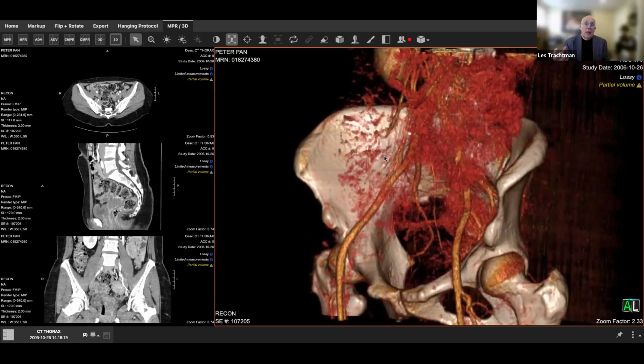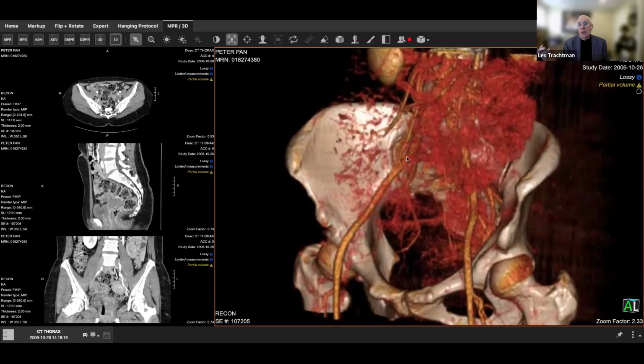In fact, Ari, as you know, but it might be worth our audience knowing, our system is also used in forensics now. So medical examiners and forensic scientists are using our system to try to understand injuries, trajectory of bullets or knife wounds, things like that. So it is really powerful stuff.